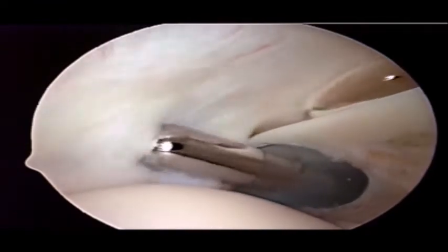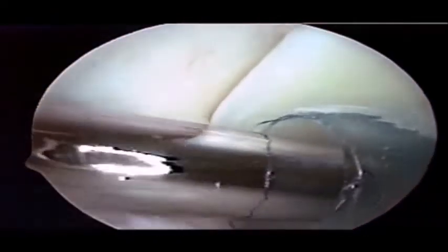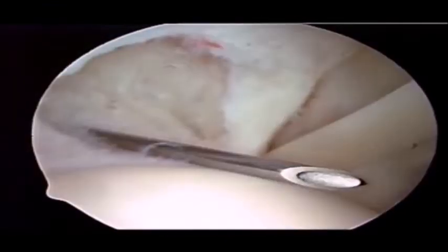Limited resection of the superior capsule exposes the intratendinous tendon tear. Resection of a slightly larger amount of superior capsule better exposes the tendon defect.